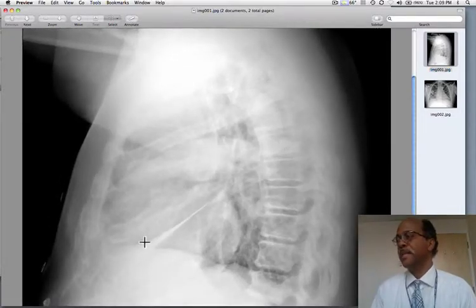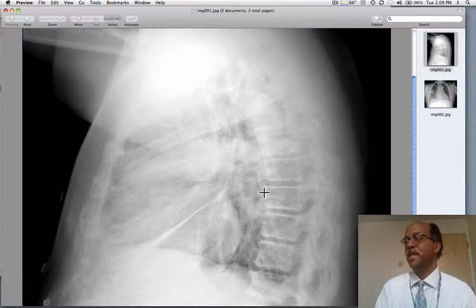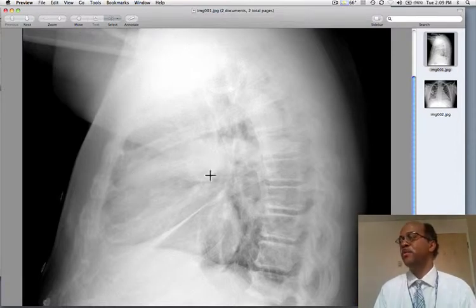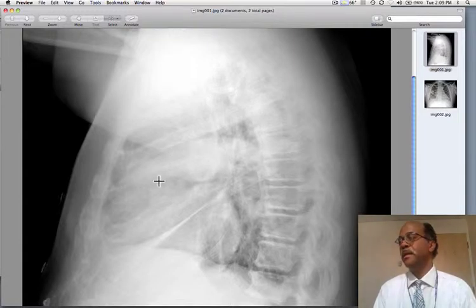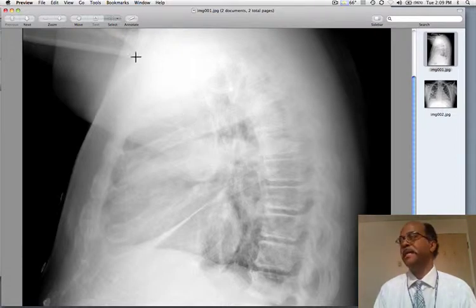On the lateral projection, we can identify the major fissure. We can see that there's fluid tracking up the major fissure. Do you see the minor fissure area? You can see that there's this elliptically shaped, smoothly marginated collection, and it's actually sitting within the minor fissure, mimicking a neoplasm.